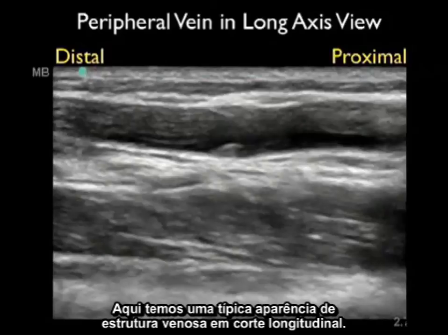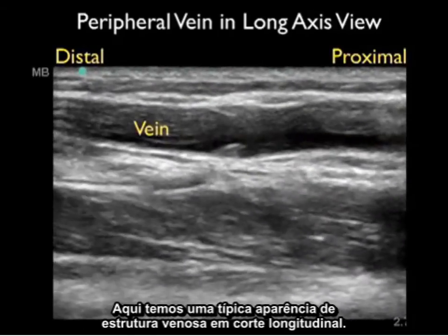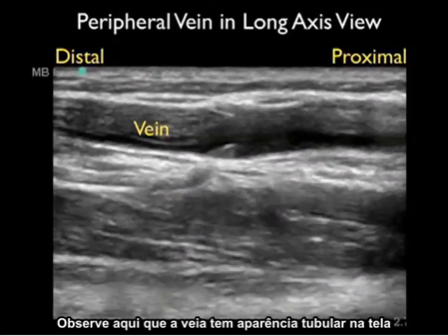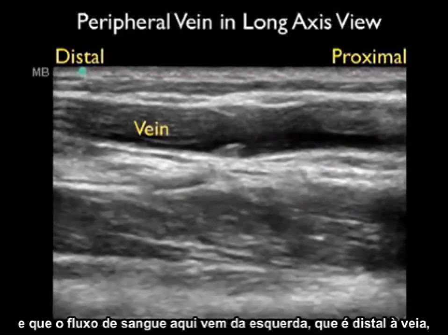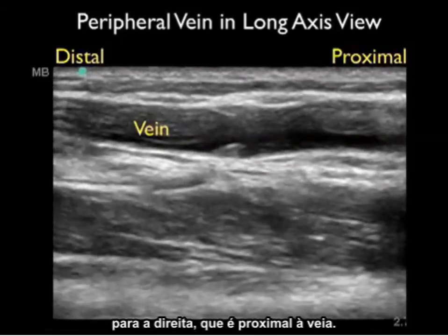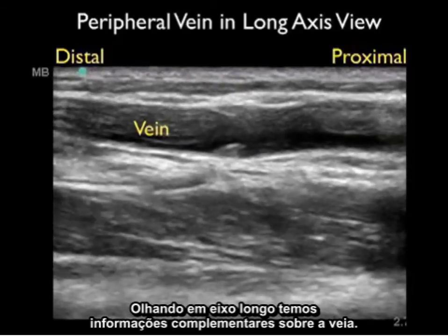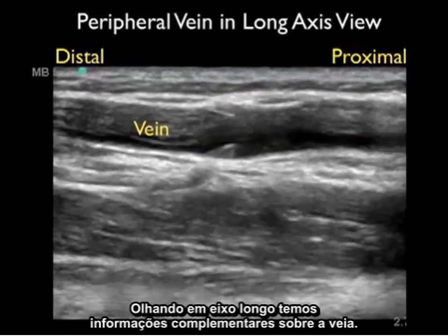Here's a typical appearance of a venous structure cut in a longitudinal or long axis orientation. Notice that the vein has a tubular appearance on the screen, and the flow of blood is from the left — which is distal — towards the right, which is proximal on the vein. Looking in long axis gives complementary information about the vein.